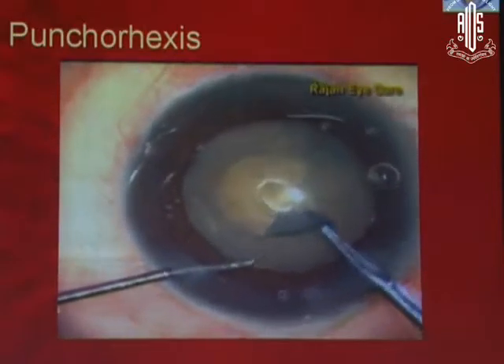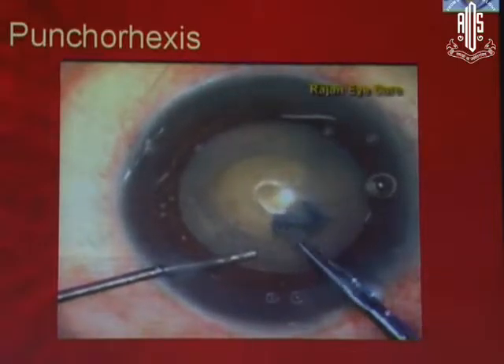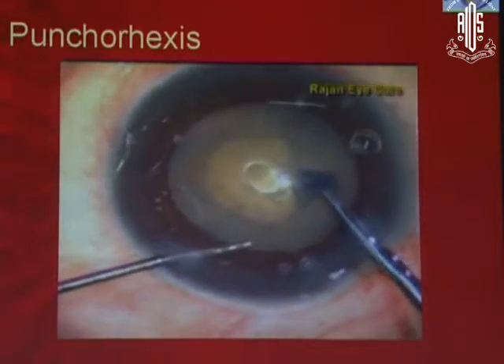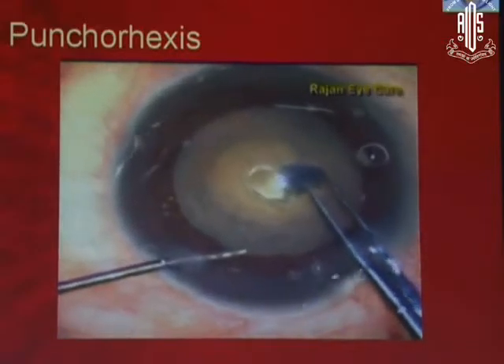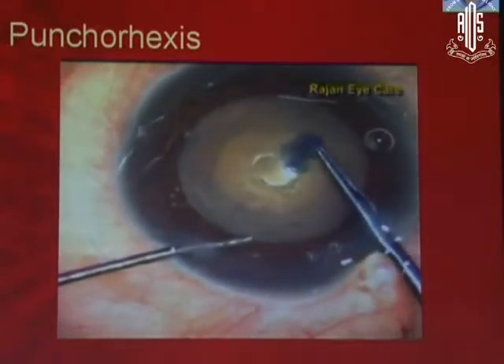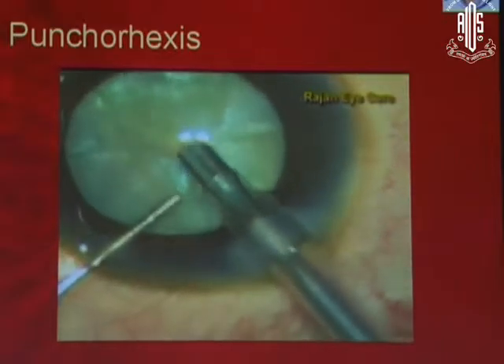To prevent that, what you do is punch the rexis and punch the nucleus as well. You can see the punch in the nucleus in this video. If you see the center, you can see the punch in the nucleus and that actually debulks the nucleus. This is actually a flare tip.